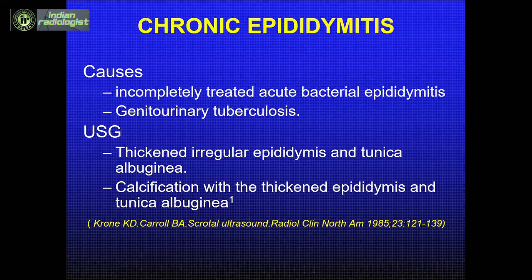But in India, genitourinary tuberculosis is very, very common and can present to you in day-to-day practice, where you get this thickened, irregular epididymis or an epididymal mass. You see calcifications within this epididymis, which is one of the clinchers to pick up chronic epididymitis.